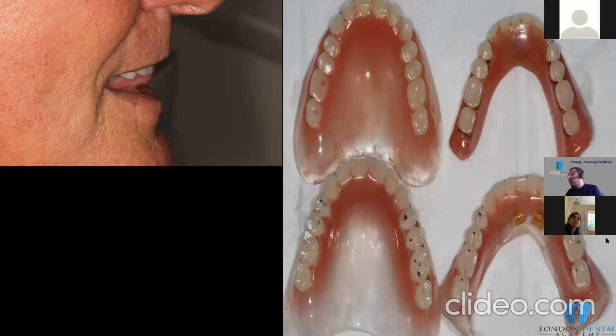So you would have gum-fitted teeth rather than a flange, because otherwise you spend hours and hours trimming the denture, bringing it back in order to get the lip support right, but you won't be able to get it. So my advice in this respect: get the wax try-in as early as possible. And as you can see, the teeth are in a very good position.